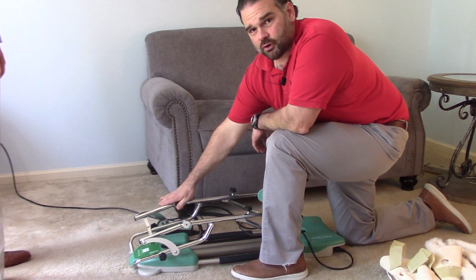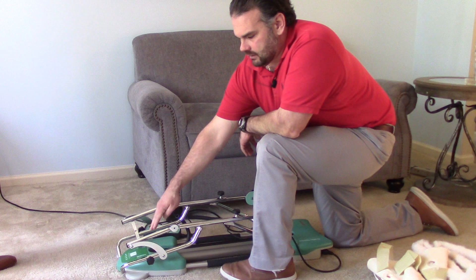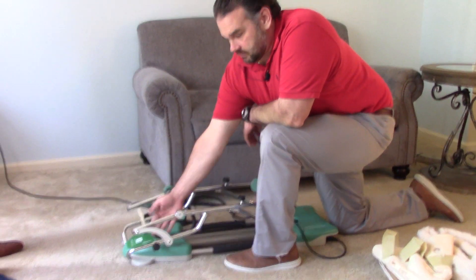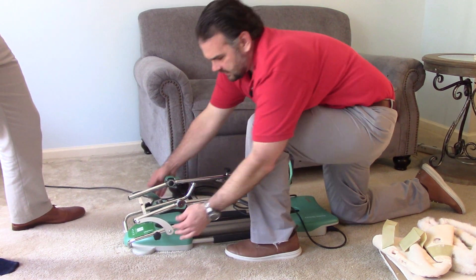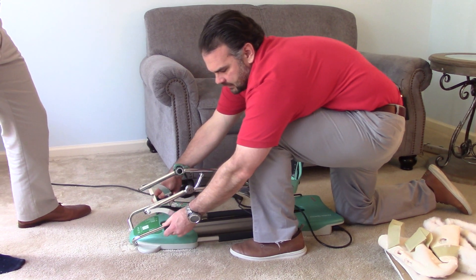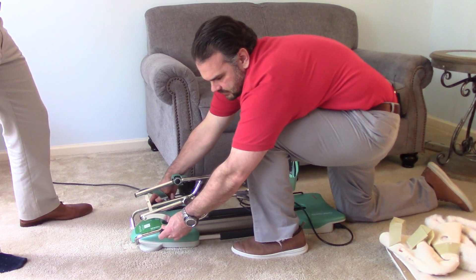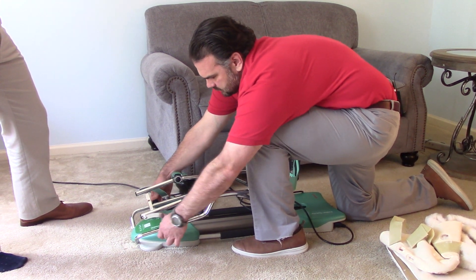In order to have the correct length from the knee to the hip, there are numbers that correspond with the amount of inches that your leg is. So in order to change that, you loosen these knobs, and you can move it up if you're taller or down if you're shorter. We'll put it at 15 like we had for Russ.